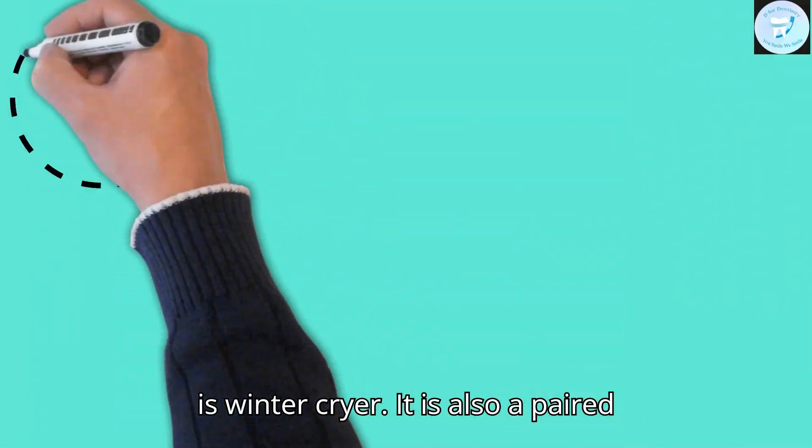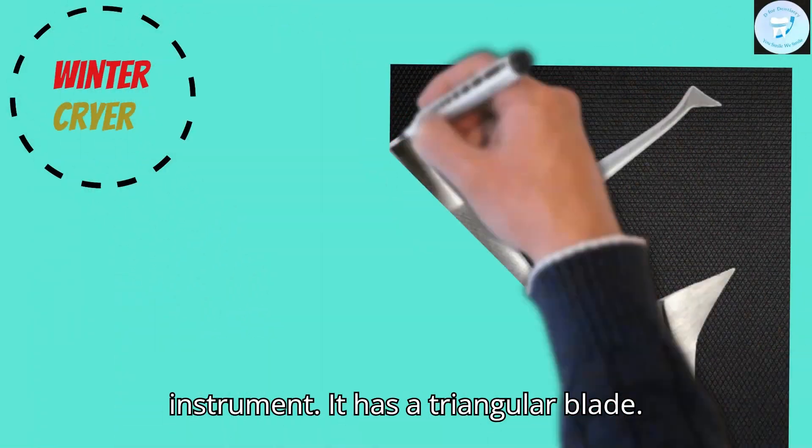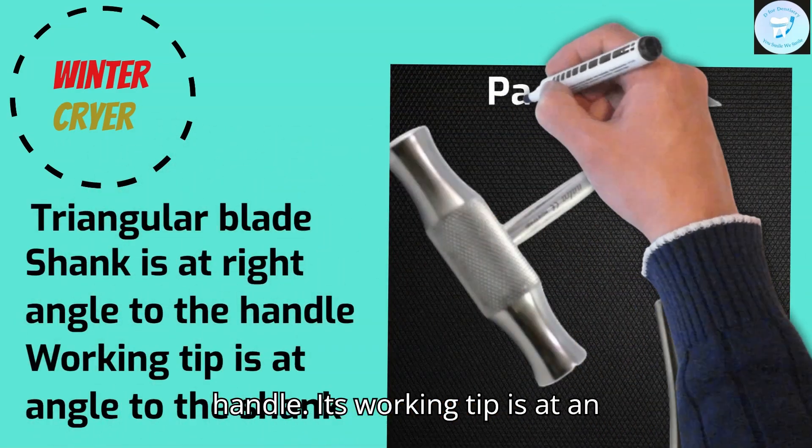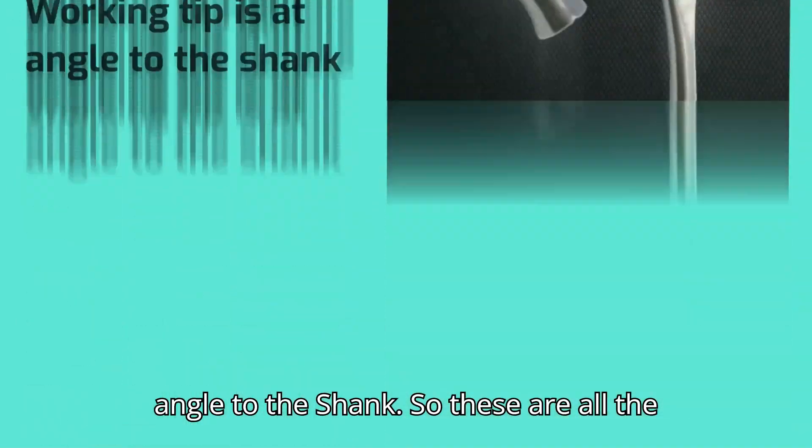This is the Winter Cryer. It is also a paired instrument. It has a triangular blade. The shank is at a right angle to the handle, and its working tip is at an angle to the shank.